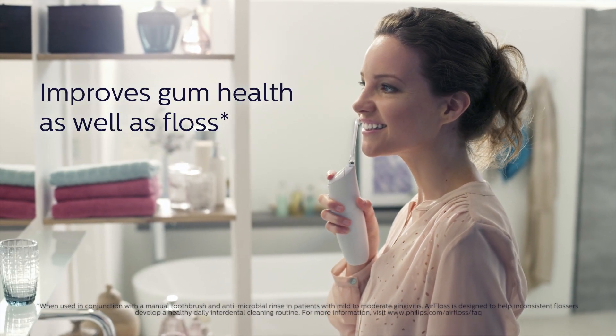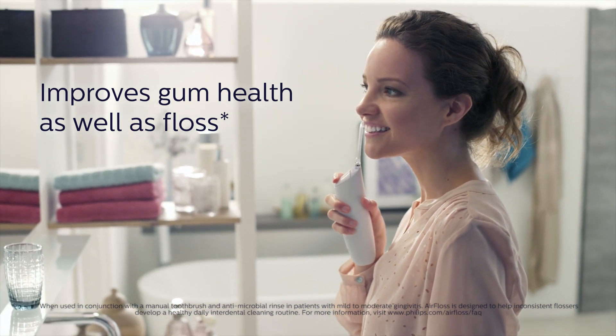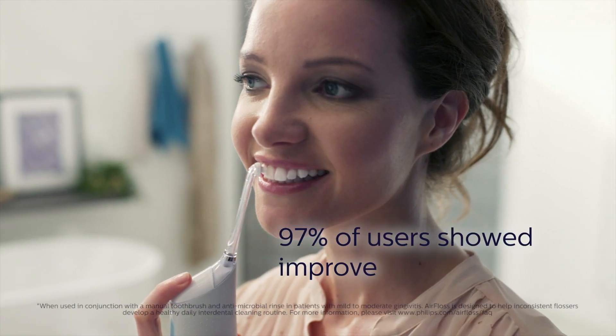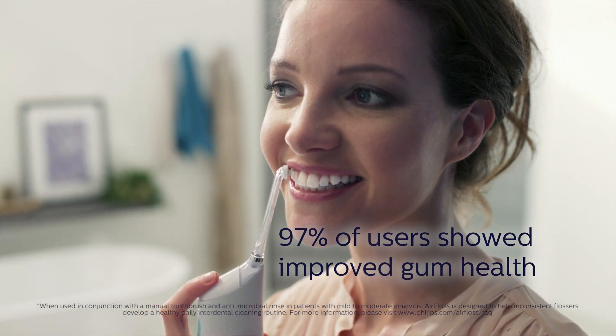It's that level of performance that makes Air Floss Pro as effective as floss at improving gingival health. In fact, 97% of inconsistent flossers who tried it showed improved gum health.